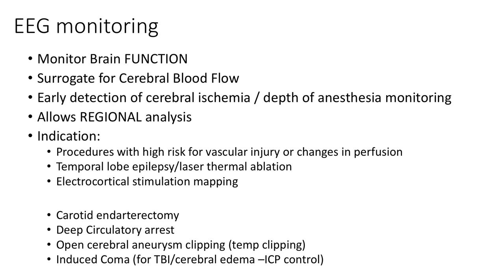Depending on how many electrodes you place, between 6 and 12, you have the option to get a regional analysis. However, more the cortical and subcortical structures, it's more like temporal, parietal, or frontal versus occipital, so brain region dependent.